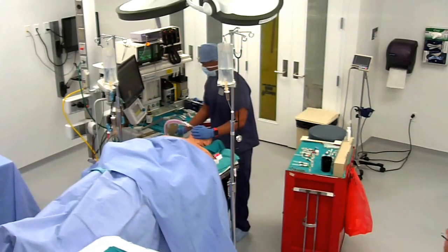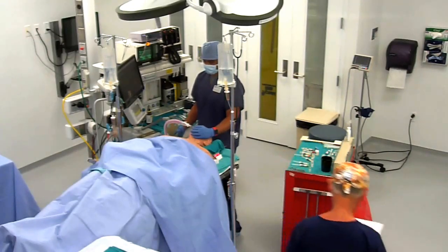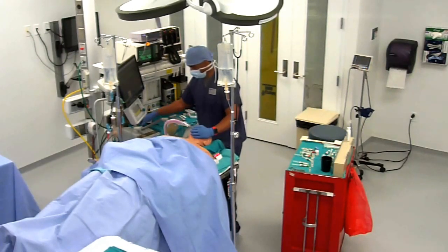So everything's going good. What are you going to be looking for? Now that I'm in the maintenance stage, I want to assess vital signs. I want to make sure my patient's comfortable as far as adequate pain. I want to make sure they're still paralyzed. And I want to make sure of the position, no pressure sores. Already said my twitches, pain, position. I want to make sure that antibiotics are given, blood if needed, anything that needs to be given is given. Also monitor my maintenance as far as my fluids and keep my fluid balance appropriate.